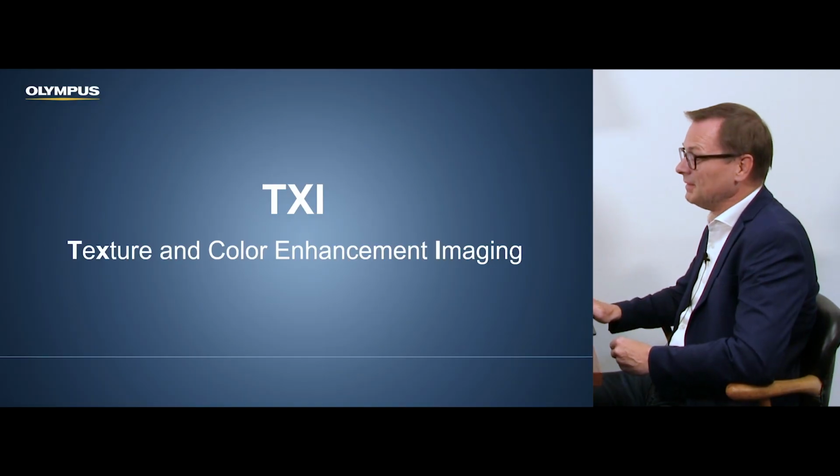You have explained the improved imaging functions of the, let's say, conventional image, but you also offer an alternative conventional image, which is quite different, and it's called TXI. So please explain. Yes, so TXI, texture and color enhancement.